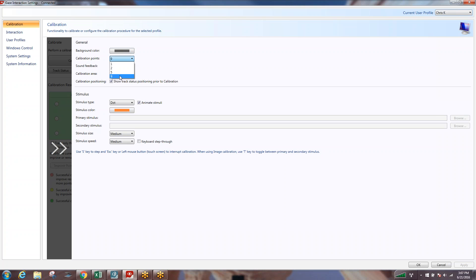If someone is going to struggle to hit nine points — nine will give us the most precise calibration — but we can also drop it down to five, two, or possibly even one calibration point if that's what's going to be successful for that particular client. We can have sound feedback changed from a beep to none, and we can also change the calibration area. We can also change the stimulus type, which may be helpful for keeping attention.